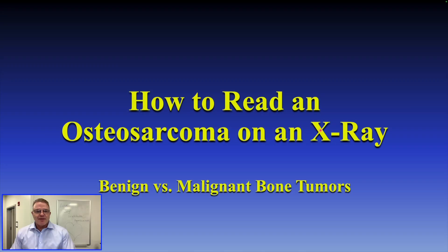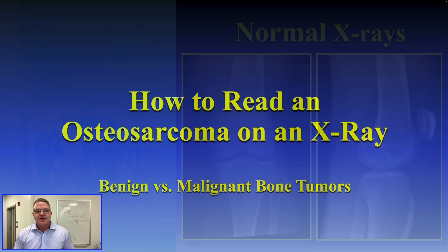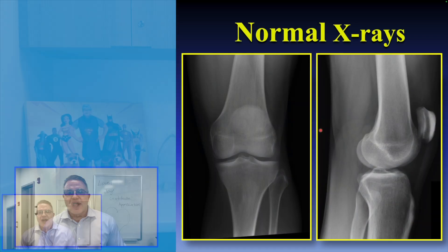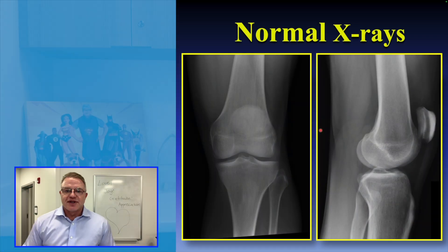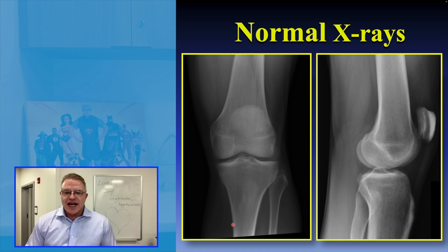Let's talk about how to read an osteosarcoma on an x-ray and look at the difference between benign and malignant bone tumors. They all have distinctive appearances. This is what normal x-rays look like — this is an AP x-ray of a knee.